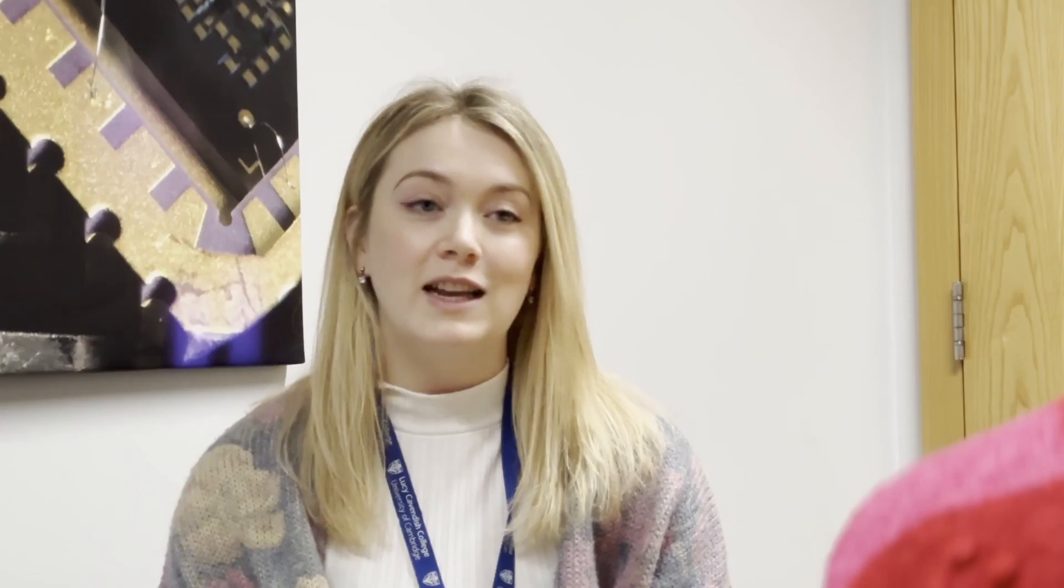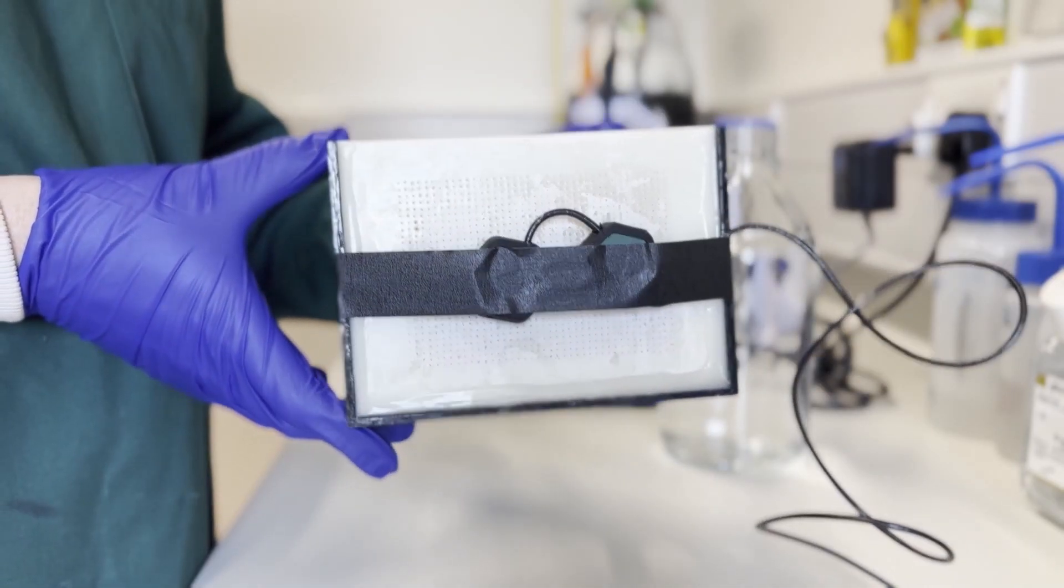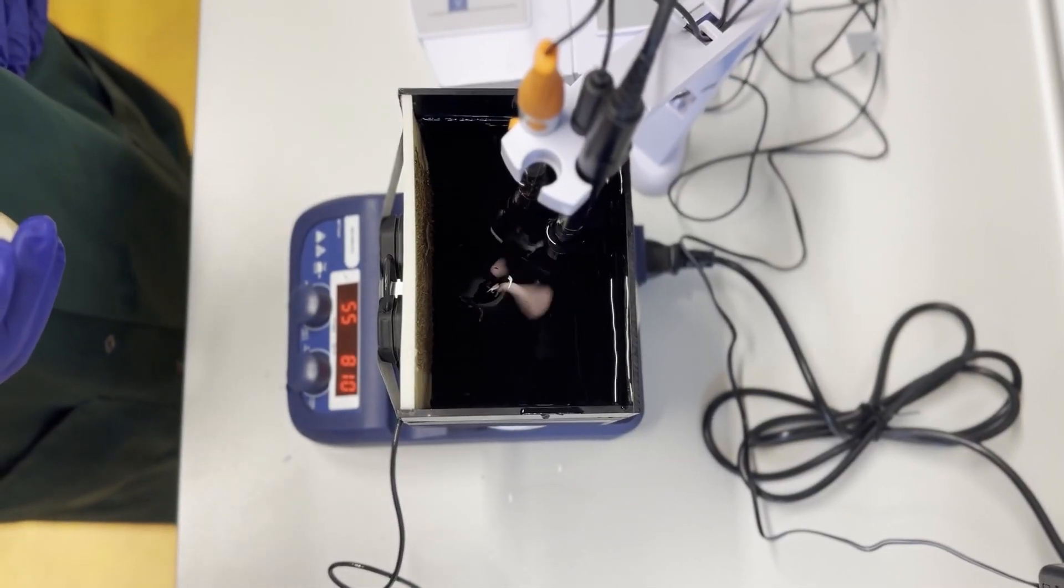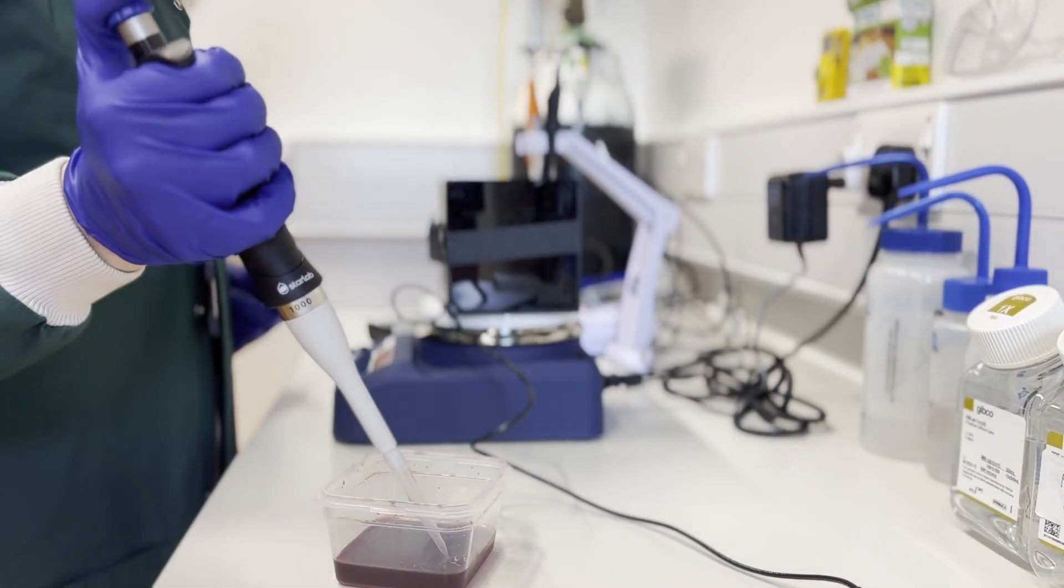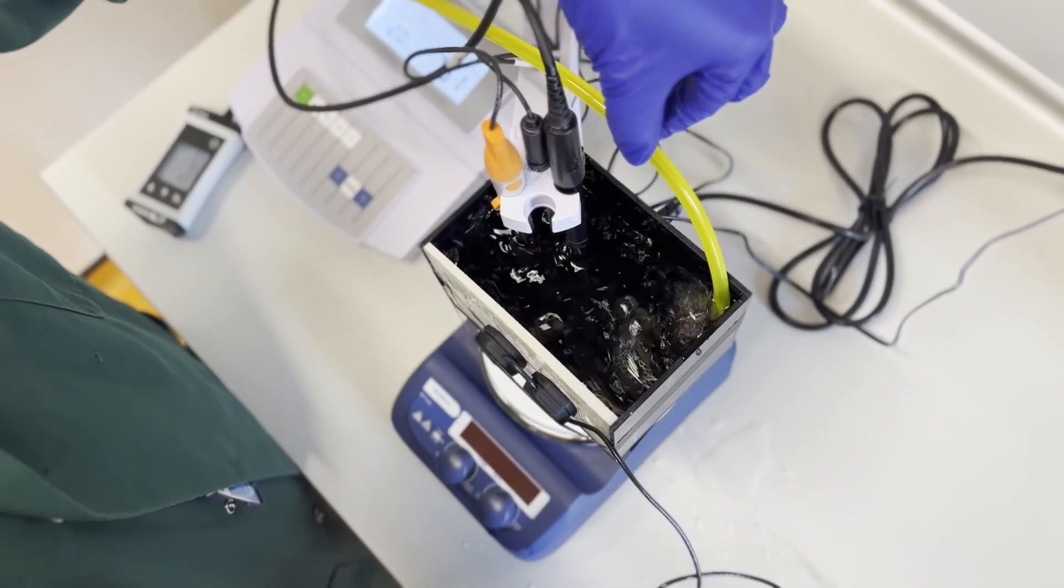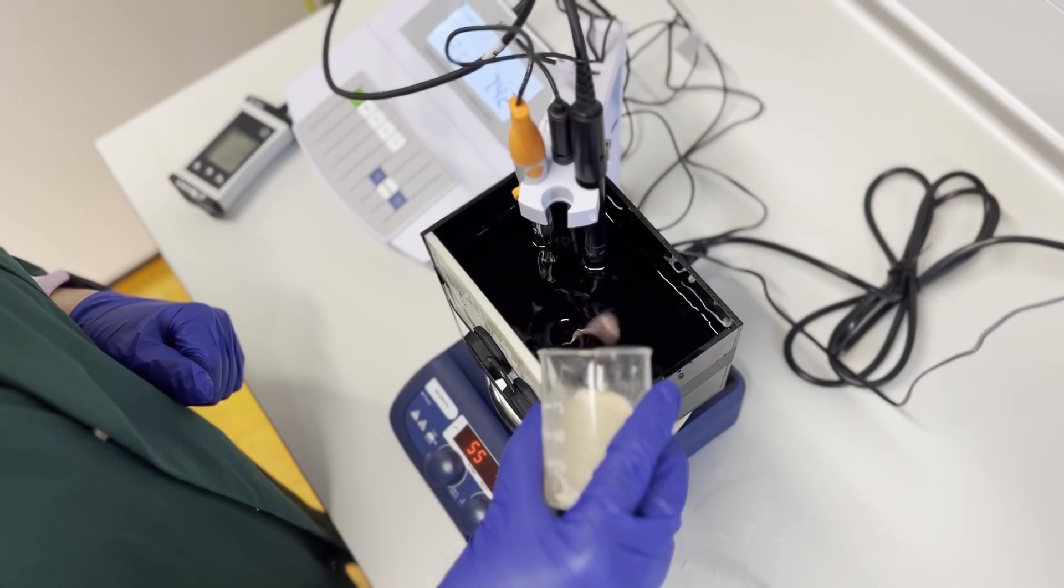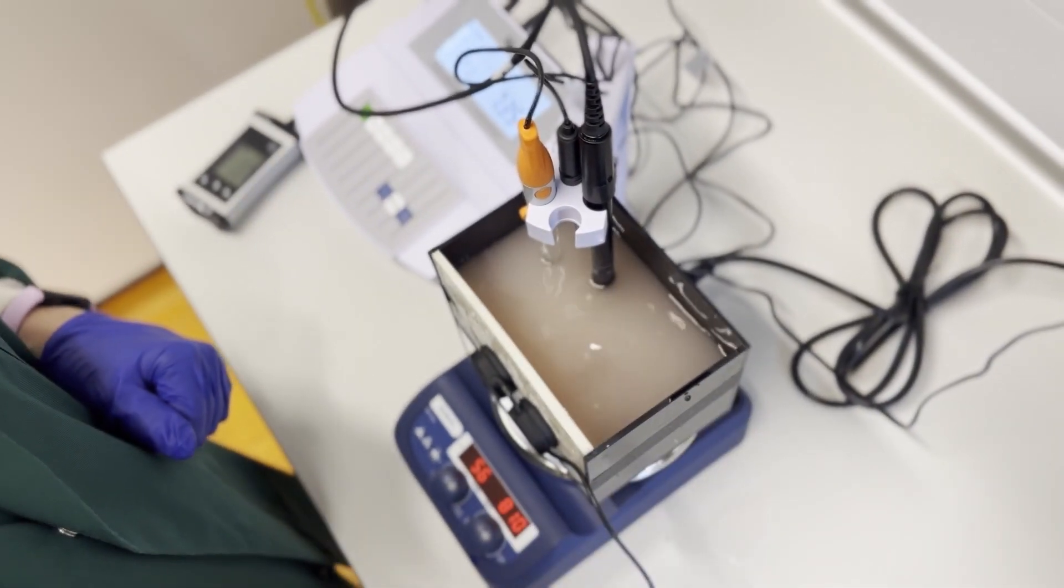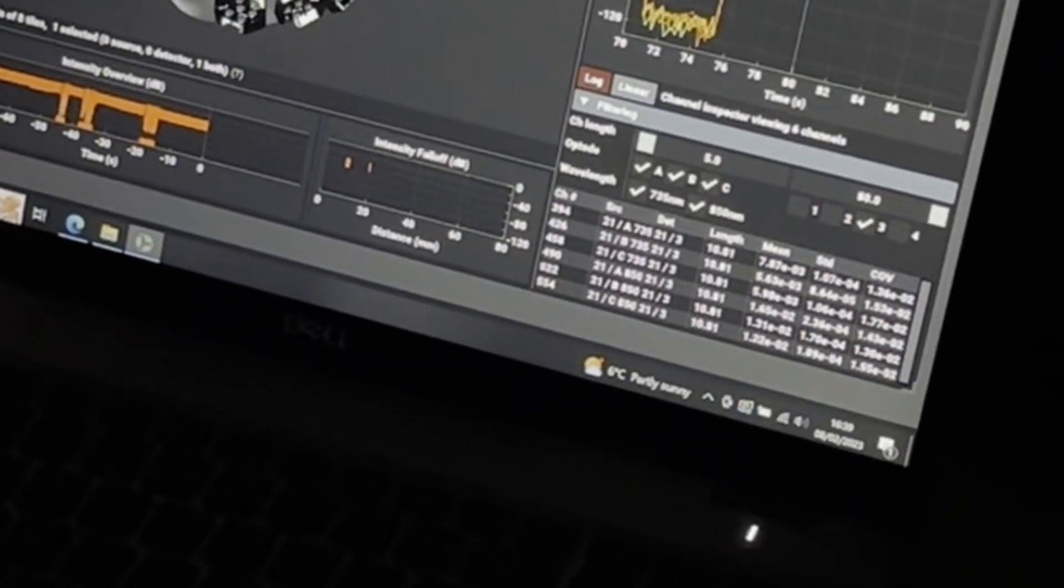These are the sensors I put on the face of my phantom—a phantom is essentially a fake brain. It consists of a box with the same optical properties as the scalp and skull, which I fill with a mixture of fat, water, and animal blood. I use oxygen gas to fully oxygenate the mixture, then add baker's yeast. This rapidly deoxygenates the mixture, simulating a stroke in my phantom, so I can see if my system picks up that rate of decline in metabolism.